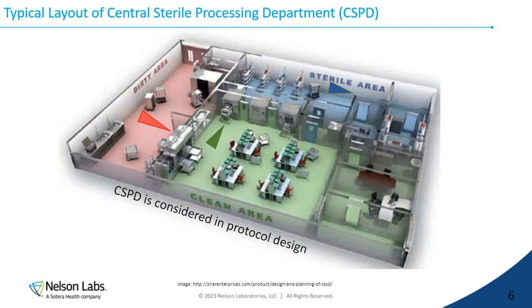We're validating what's happening in the hospital, right? Manufacturers give us an IFU. When we're using the IFU, we're validating the IFU, but we also have to keep in consideration that these IFUs are going to be followed by healthcare. And so when we design a protocol, we're designing how the devices will be used, how they will be brought in, and what steps are going to be taken.